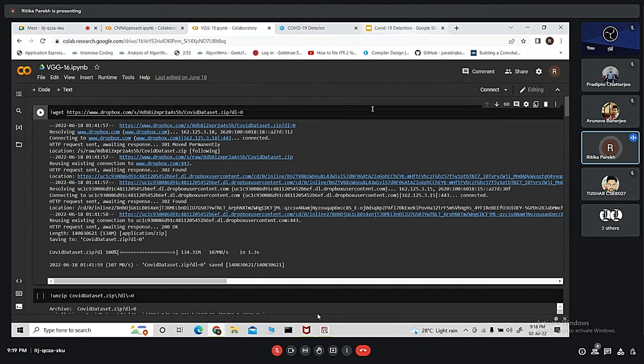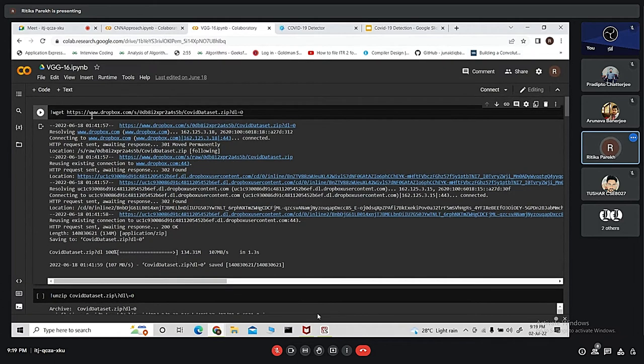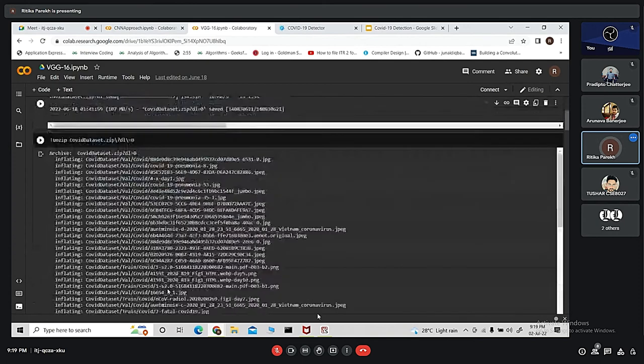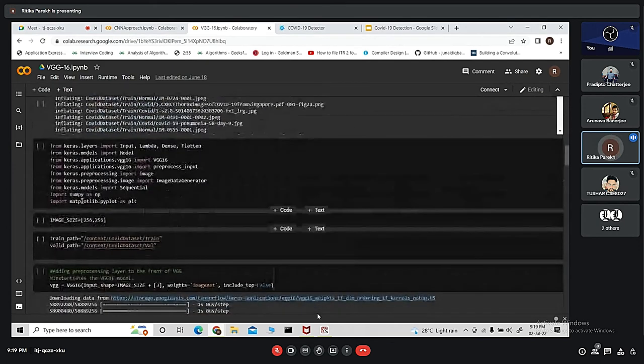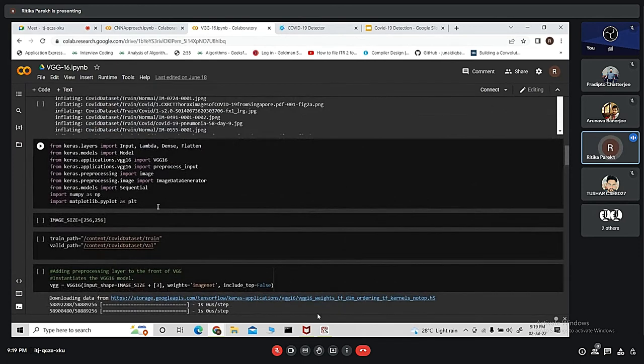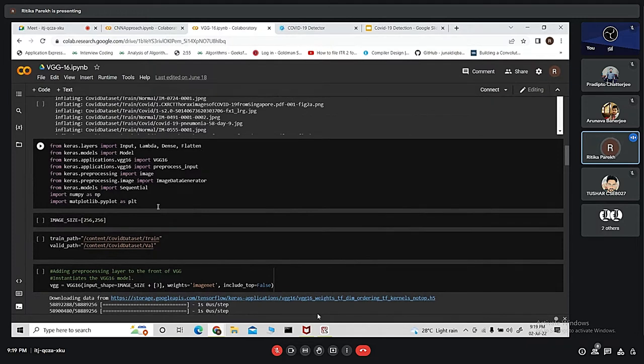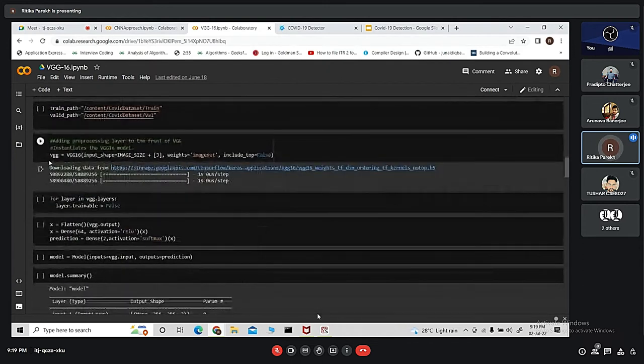Next we have used VGG16 approach, that is the transfer learning technique, in order to detect if a person is COVID positive or negative. Here we have taken the dataset from Dropbox and unzipped it. Next we have imported the important libraries from keras.models and keras.application, NumPy for numerical operations, Matplotlib for graphical representation of the data, and so on.